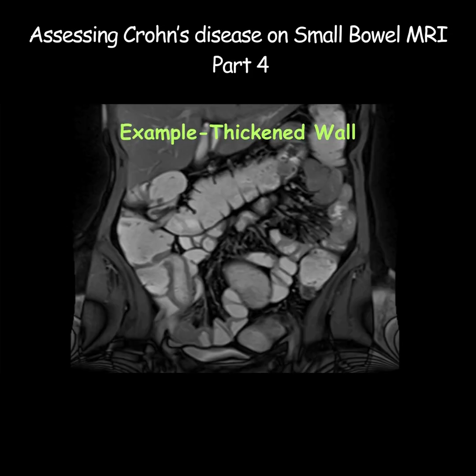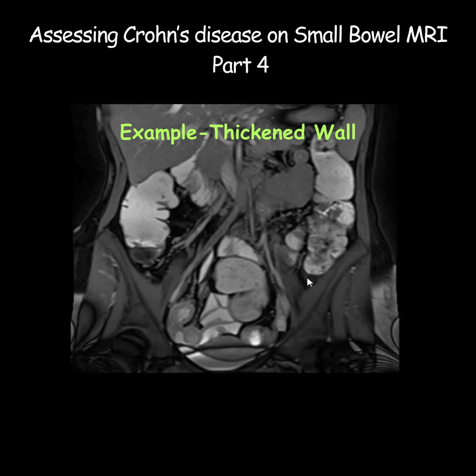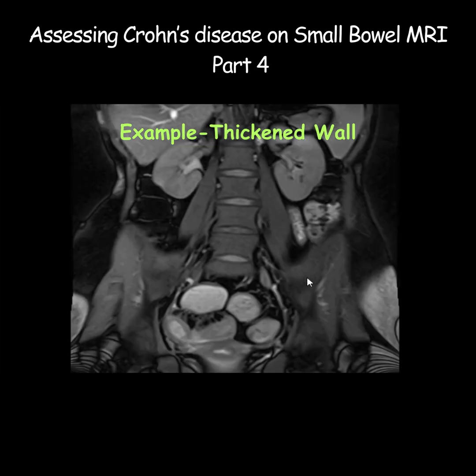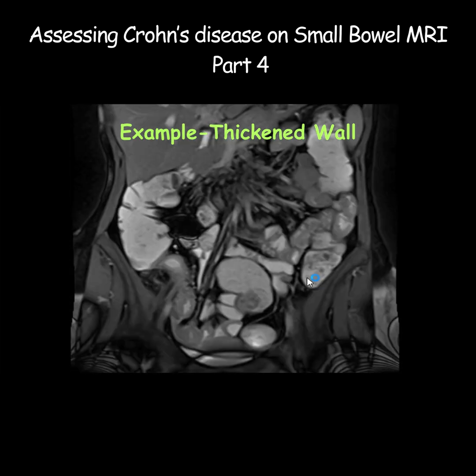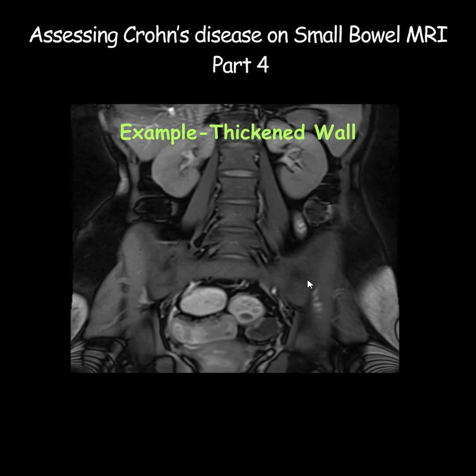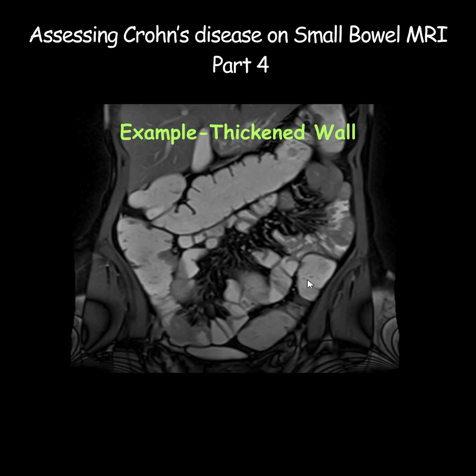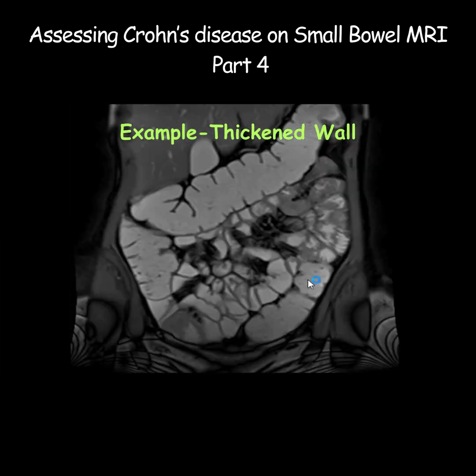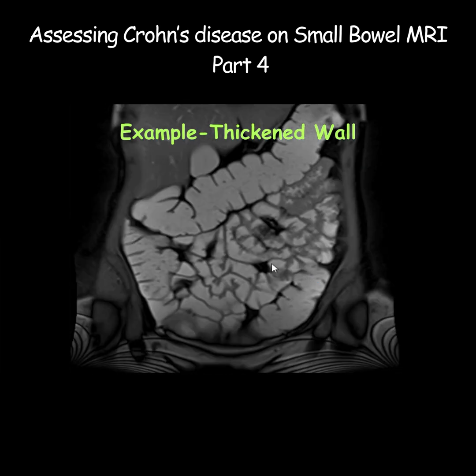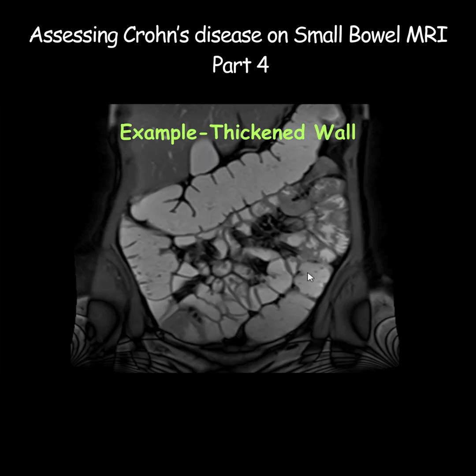Let's look at an example now. This is a T2 fat sat image and I'll scroll through the images. Do you see any abnormality? Well, you can obviously see several small bowel loops and they appear to be adequately distended and show thin walls.